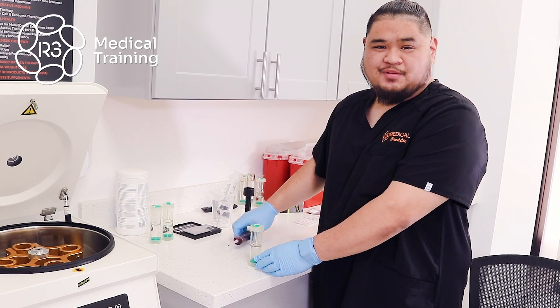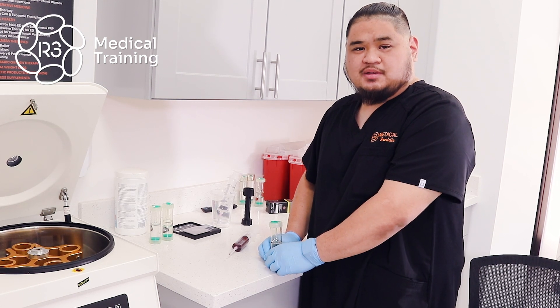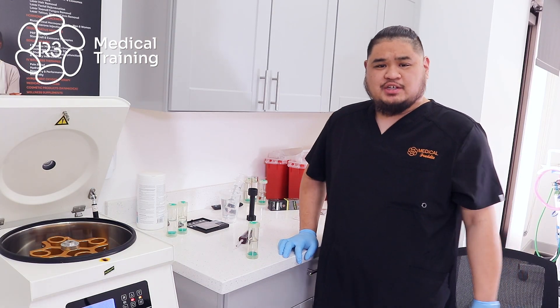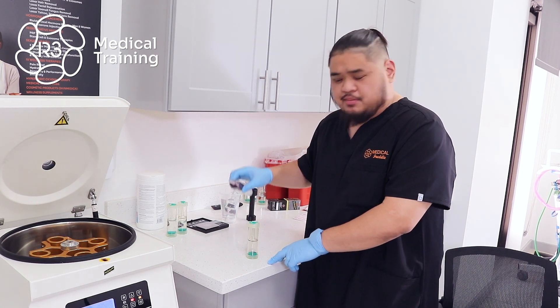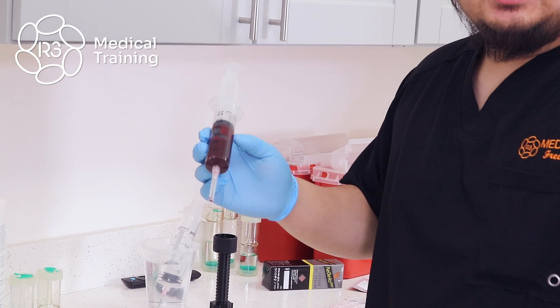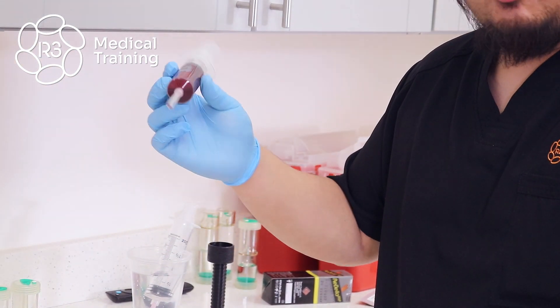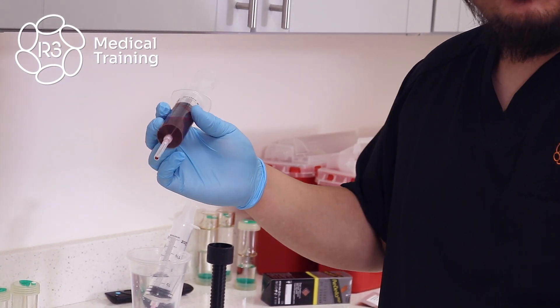Hello everybody. My name is Freddy and I'm going to go over how we process the 30 cc ReDella PRP kit. We've just completed a patient blood draw, so the next step in the process is to add the blood sample into the PRP tube. In the syringe we have 27 cc's of whole blood with 3 cc's of anticoagulant, just to prevent the blood from coagulating while you're in the process of doing PRP.